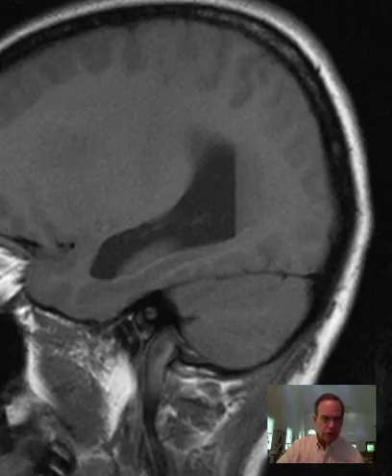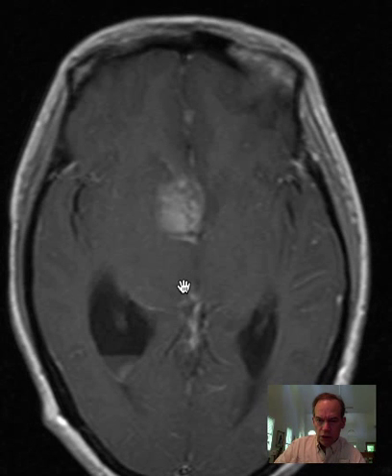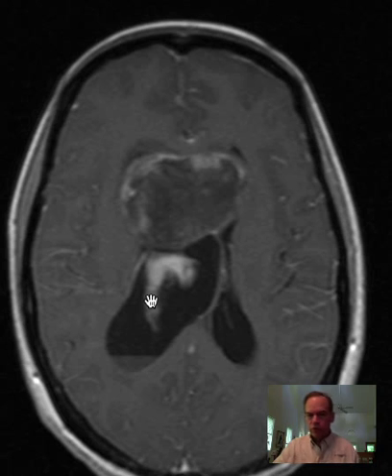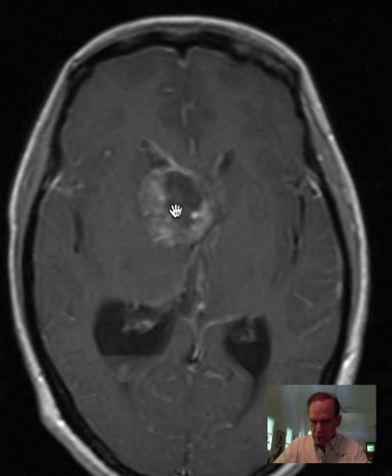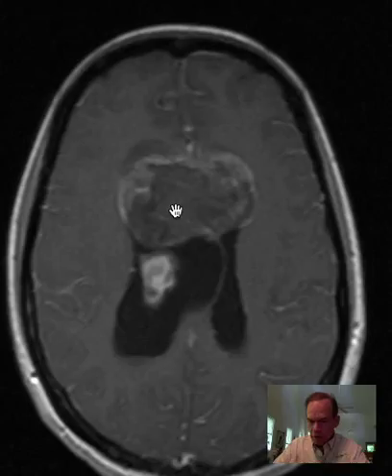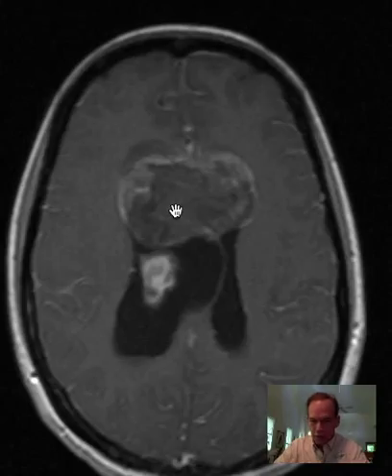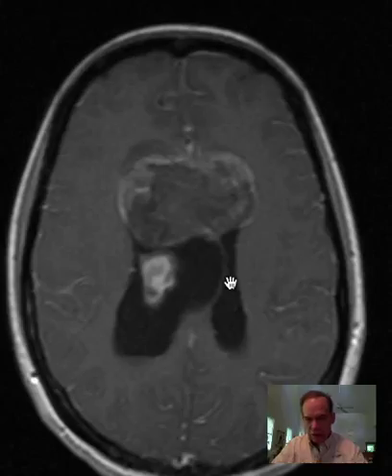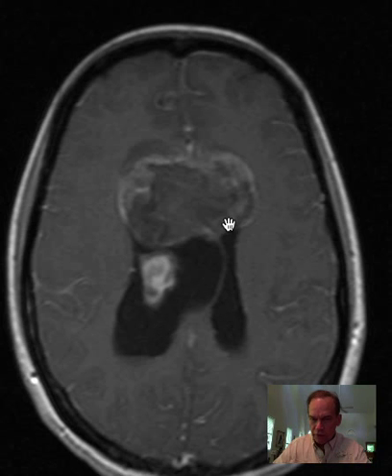Let's see what this looks like on contrast T1-weighted MR images. Here are the T1-weighted images post-gadolinium. Now we know that bright signal here is not necessarily enhancement, because there is blood there in a similar distribution. Some of this may be enhancement, and I would suspect it is, but a lot of it is just hemorrhage in the perimeter of the tumor that we were able to see clearly on CT — and CT still has its value despite all the achievements of MRI. The intraventricular septum is bending and displaced to the left because of higher-grade obstruction of the right lateral ventricle compared with the left.